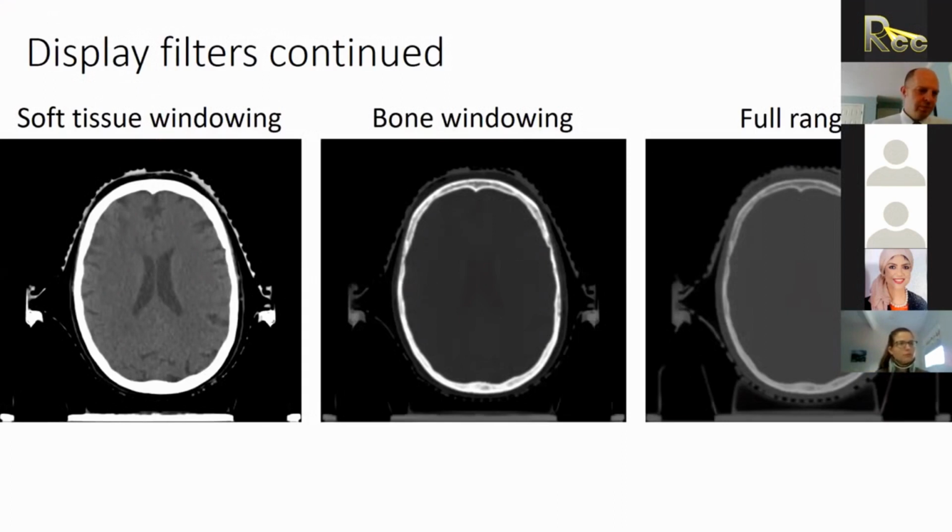Okay, Rashid asked, is gapping an acceptable method to avoid overlap? So we were talking about gapping for craniospinal cases. I think it really depends. For instance, if we do a small gap for a craniospinal case with multiple fractions, we'll probably change where that gap occurs. So move the fields, make one larger, one smaller, and change the gap location so that we don't get a cold spot every single time.